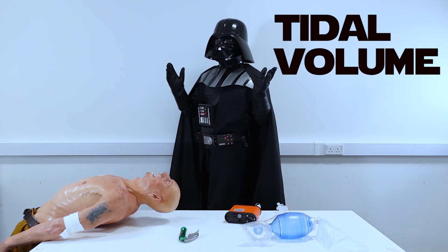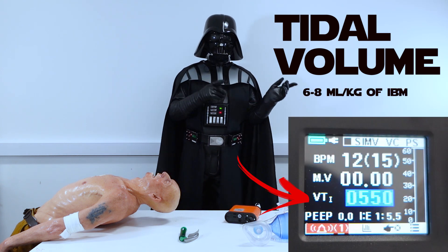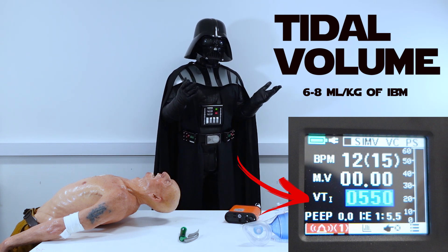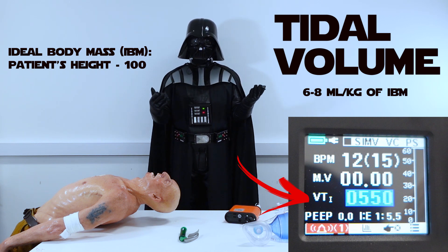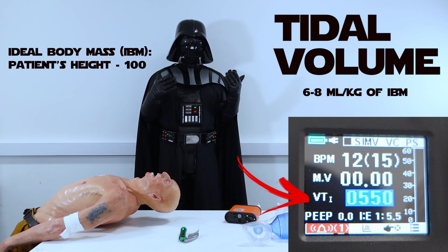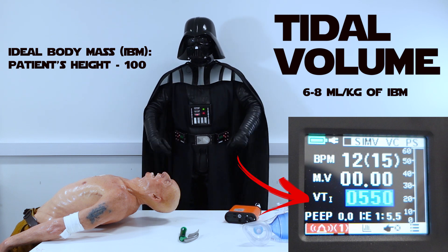Tidal volume — different textbooks will give you different numbers, but usually it is 6 to 8 ml of air per kilo of ideal body mass. To calculate ideal body mass, estimate your patient's height and deduct 100. So for a 190 cm patient the ideal body mass would be 90 kg, for a 165 cm patient it would be 65 kg, and so on.